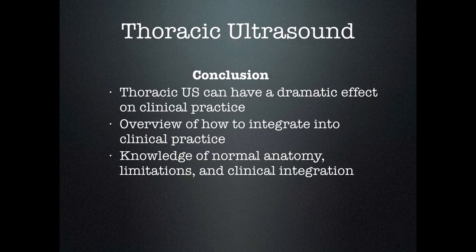And once you start integrating it and getting a few examples and correlating it with CT or chest x-ray, you'll see how the knowledge of this can help you differentiate between a lot of clinical entities that can cause chest pain and shortness of breath.